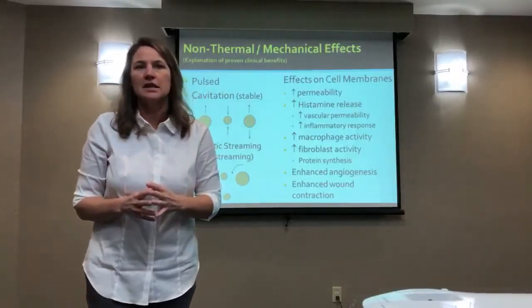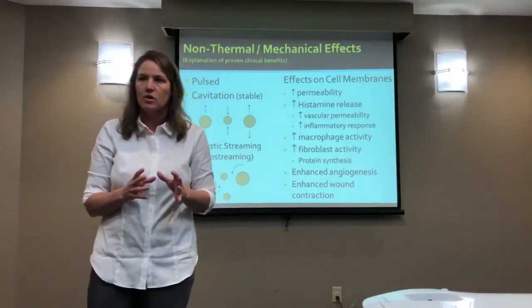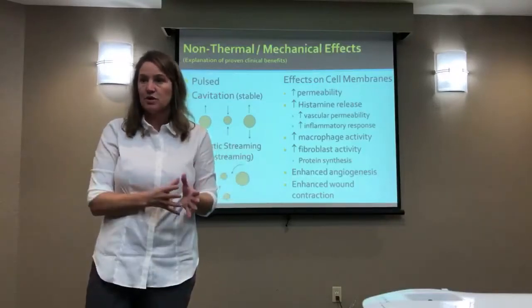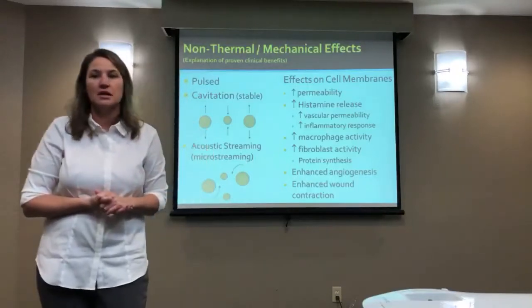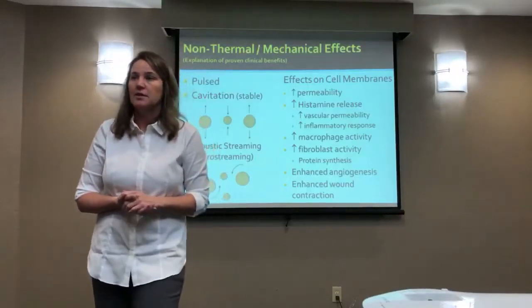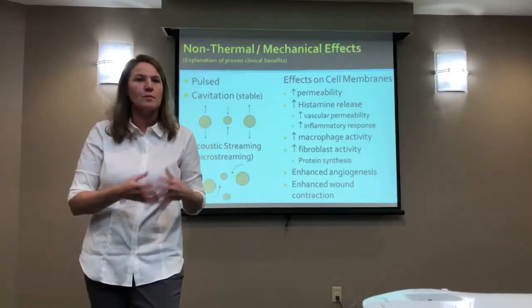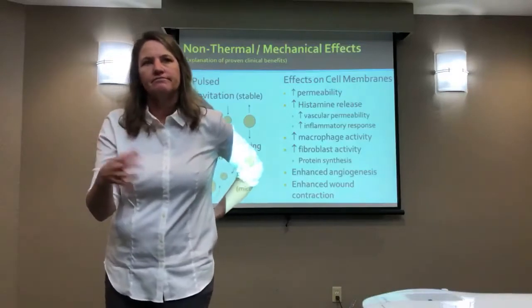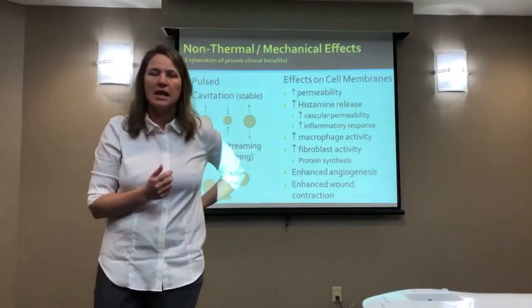So the idea there is don't treat any area that's avascular. Ultrasound can cause heat on any setting at all if it's put over non-vascular tissue. So there's certain tissues of your body that you should never ultrasound anyway because it can't dissipate heat. It doesn't safely absorb and dissipate the way it should. And that's the reason various people have documented, don't call it non-thermal, call it mechanical, call it subthermal in most tissue.